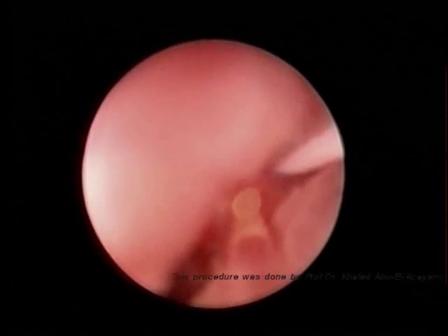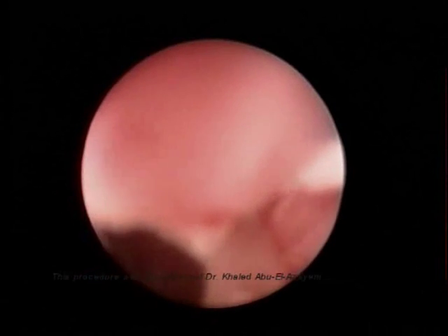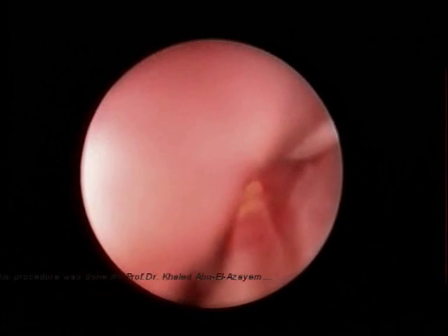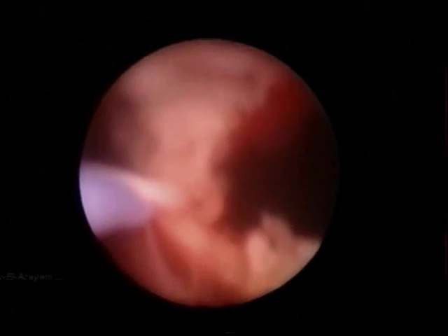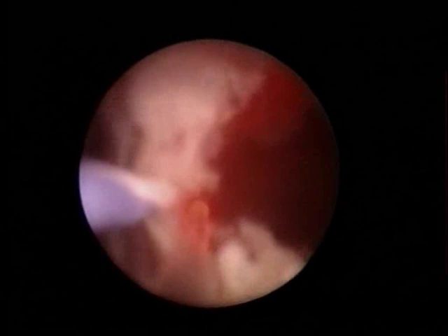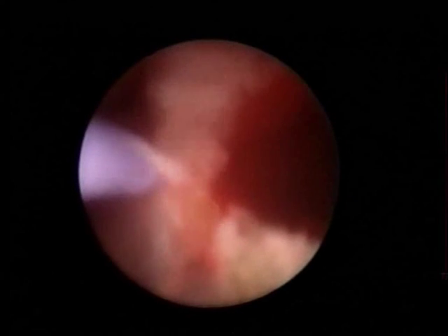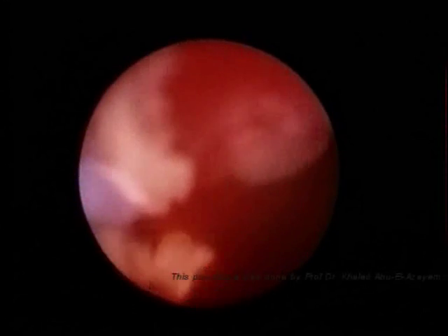Now we are extending our laser incision through the wall of the ureter and the pelvis at the pelviureteric junction. We have to cut all the layers of the wall until we can see the periureteral fat.